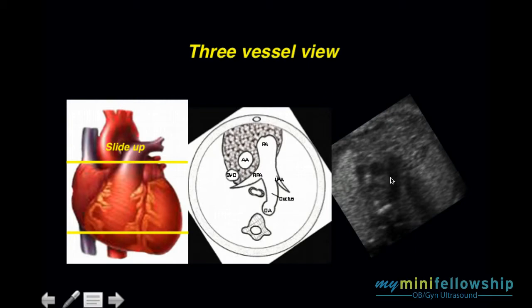Here we see a sonographic representation of the three-vessel view: SVC, ascending aorta, and pulmonary artery. In this instance, the branch visible is the ductus arteriosus going back to the descending thoracic aorta, sitting just in front of the spine. So: SVC, aorta, pulmonary artery, ductus arteriosus.